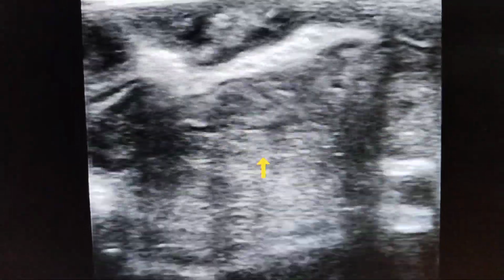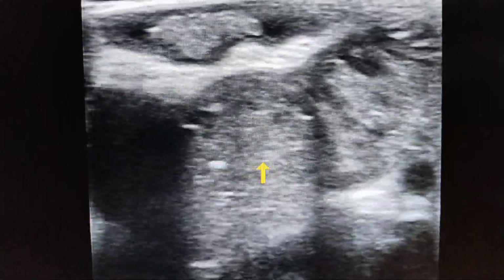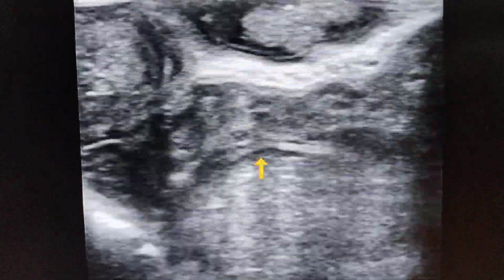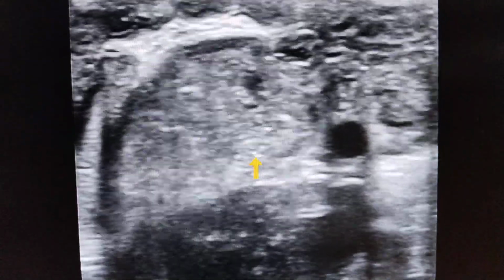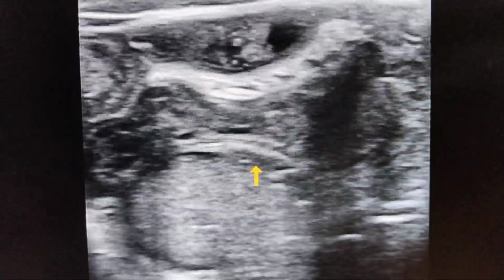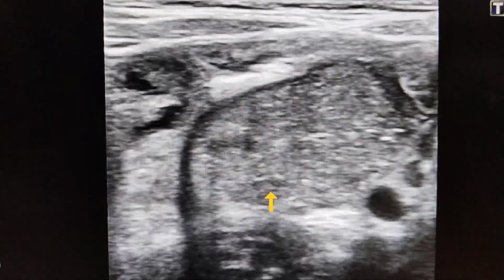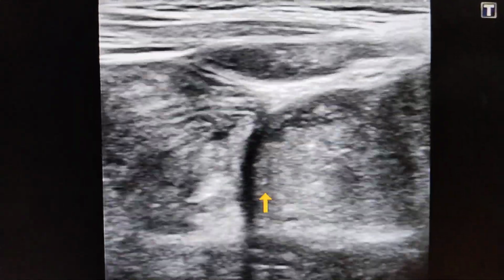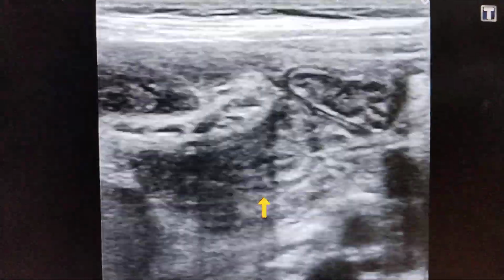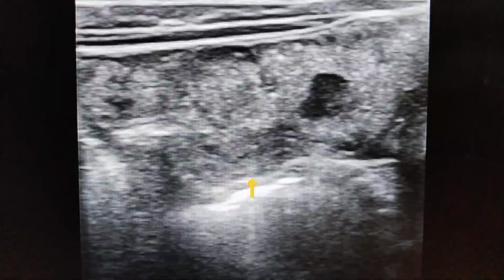In conclusion, celiac disease due to gluten allergy characterized by semi-dilated hyperperistaltic jejunal and ileal loops with putrefied food particles within the lumen, acting like a washing machine, that is washing the clothes in a swirl pattern, associated with right mesenteric lymphadenopathy. Thank you very much.